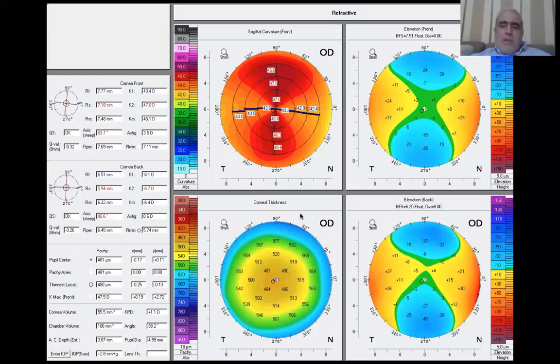Dr. Mazen, the old era of the flying spots and the multi-fly spots and the broad beam was horrible. I remember when I started in 1992, we used to keep the patients for months on steroids for fear of the haze, because we didn't use mitomycin at that time. At least 25% of patients had some kind of significant haze, and we had to do a lot of redo because of haze, not because of undercorrection.